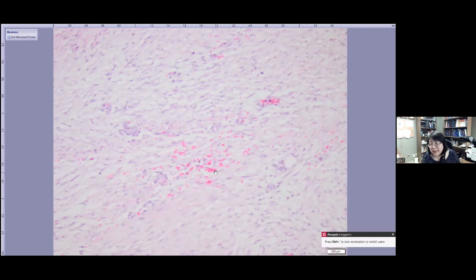So this is a benign lesion. Also, the imaging and clinical presentation look very aggressive. Still it is a benign lesion, conservative treatment. So just remember this category, cranial fasciitis.